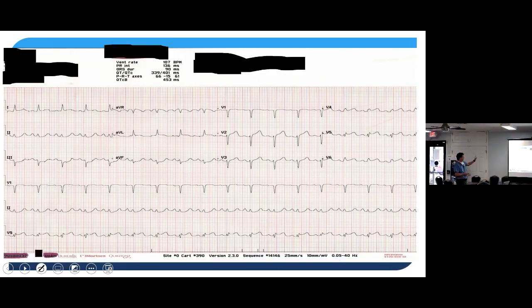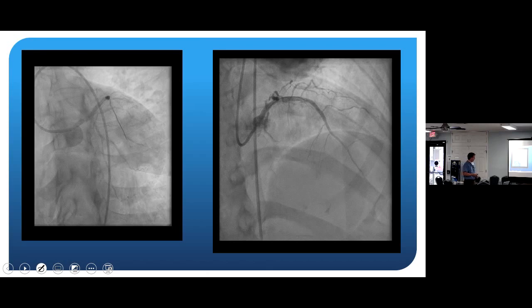So back to his EKG. This was the EKG. The second one was pretty bad. This patient gets to the hospital, gets to the cath lab, and these are the cath pictures. I can't make the videos load for some reason. But you can see the dye squirted into the artery, and there's a blockage. They go in, rotor-root it out, put a balloon in there, put a stent, and now you can see we got great perfusion going through there.